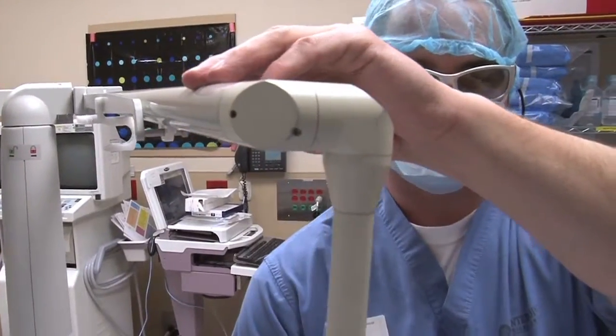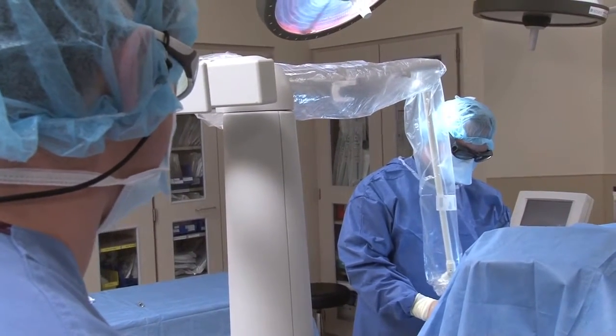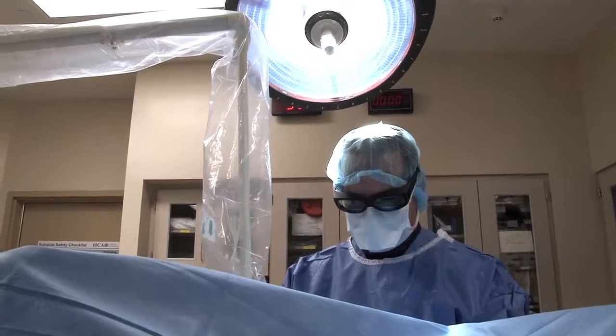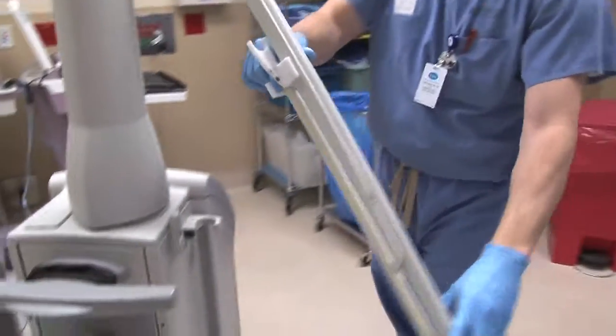After deploying the arm, monitor the space around the arm to prevent it from being bumped and potentially knocked out of alignment. Once the physician has finished using the laser, stow the arm so that it is out of harm's way.